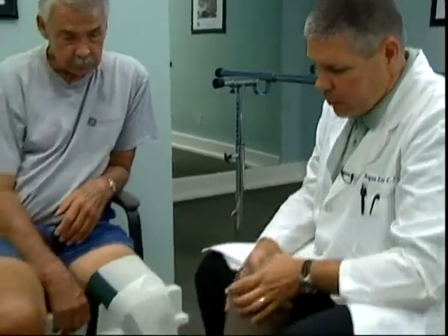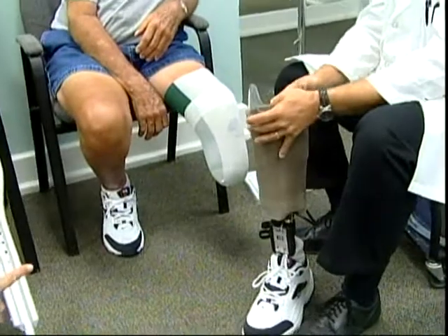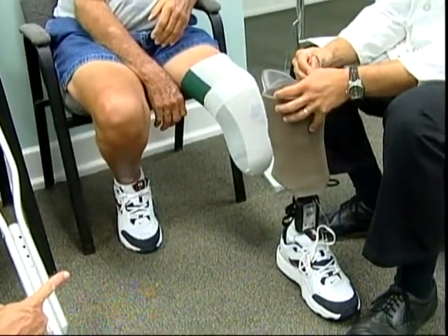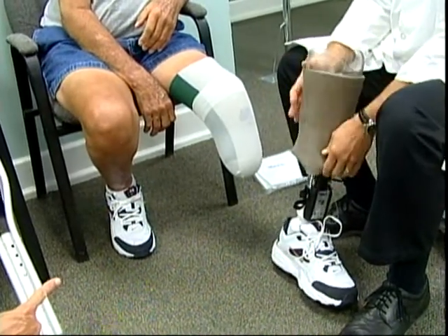So now this looks different than what you left with. That's right. Tell us what you've done. What we've done is, the first thing that we did was Tony was feeling a little bit of pressure on his condyle, so we heated the socket and relieved this area. And then we added the vacuum system.